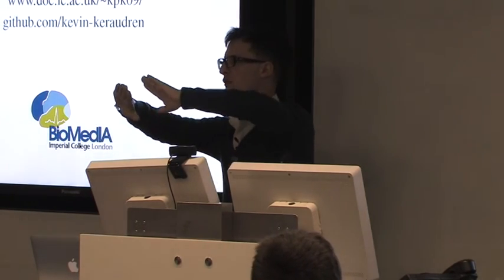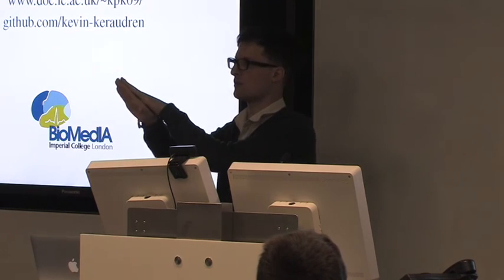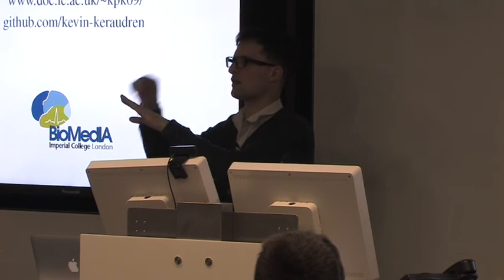still one thing which is missing, which is when you work on the brain, if the fetus moves a lot, those coordinate systems you get from the scanner are not enough to initialize the motion correction, because if you move too much and there's not enough overlap between the images anymore, realigning them doesn't work well. And in that case, what they do is manually initialize this alignment. And in that case, they don't really need my work. So something which is missing from what I did is finding the orientation of the brain as well, so that I could help them align these images better.